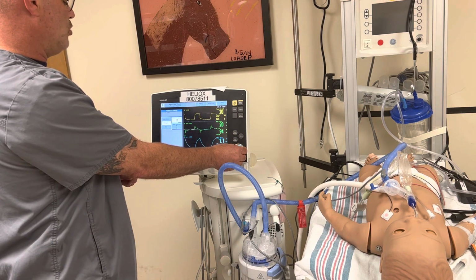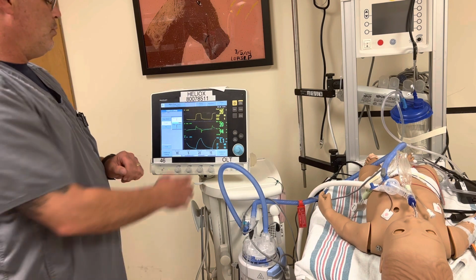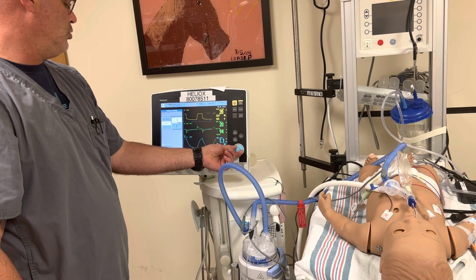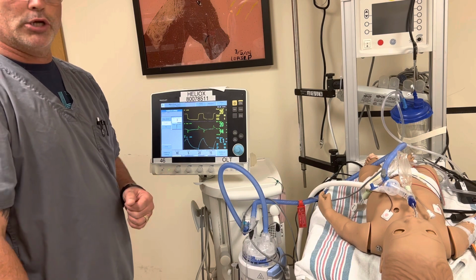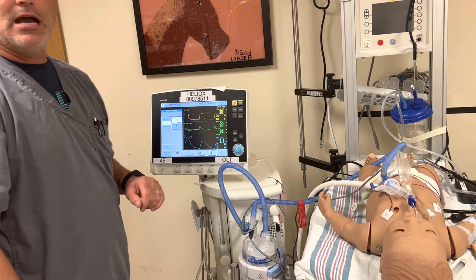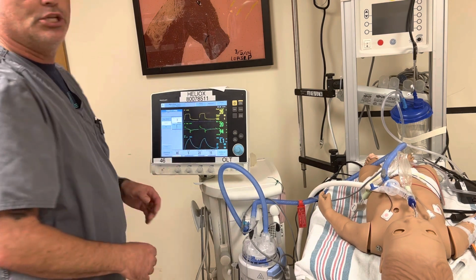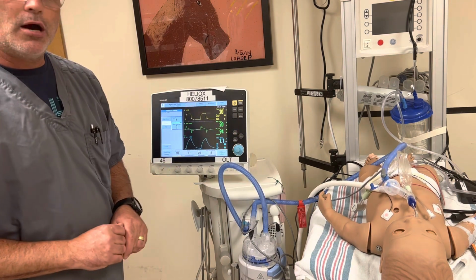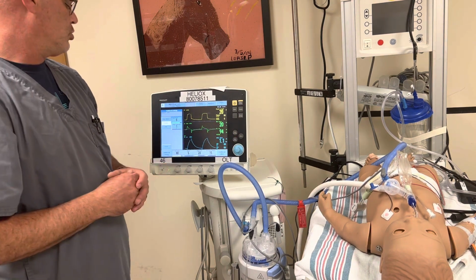Now, if we get the flow trigger down to 1 on the flow trigger side, and it's still occurring, then we are able to move into pressure triggering to get rid of it. And we can continue to move into pressure triggering, again, by policy, as sensitive as possible without auto triggering occurring. So if I have to get into a -3 of a pressure trigger for the vent not to auto trigger, then that is what we do, right? If we can set it to -5 without that auto triggering occurring, that's what we do. As sensitive as possible without auto triggering occurring.